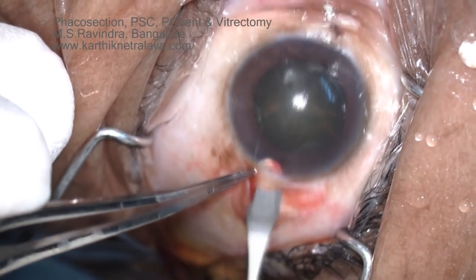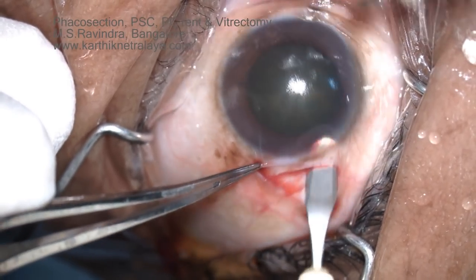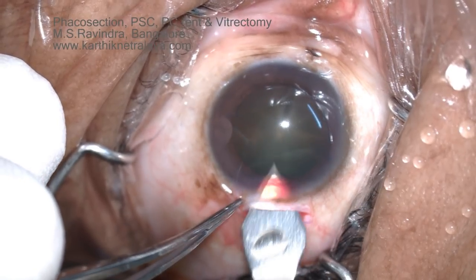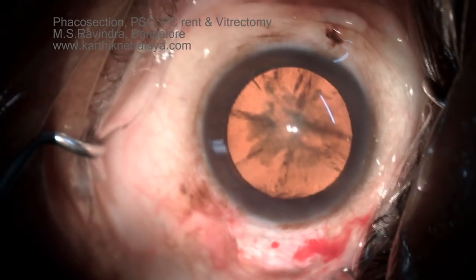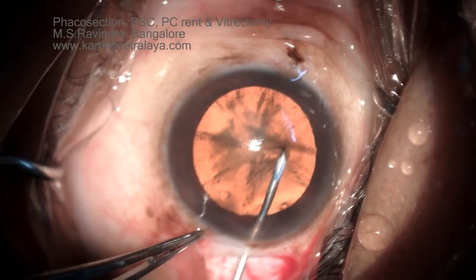Surgery is being done under topical anesthesia. A small amount of cotton is placed in the surgical site and soaked with paracaine. A small entry is made into the anterior chamber at the anterior end of the tunnel, with a tunnel floor pinpoint entry.